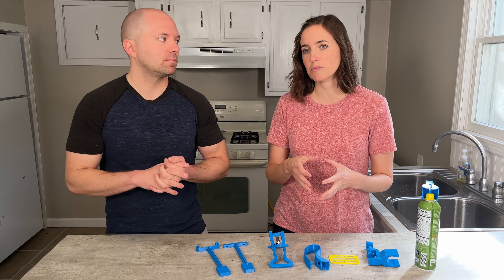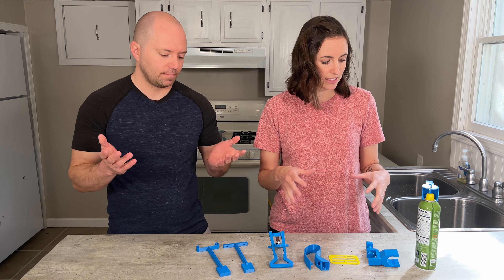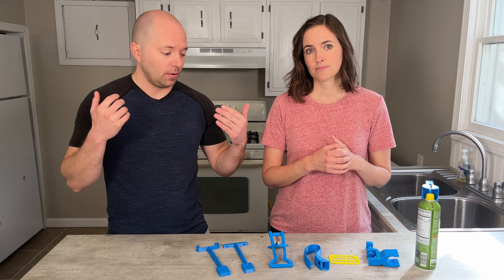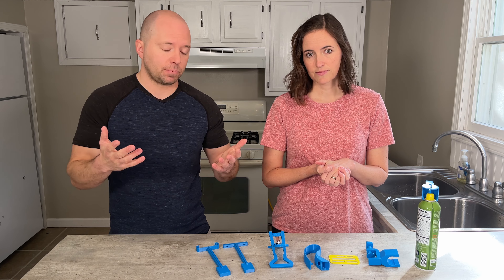We've been 3D printing pretty extensively and we're excited to talk about how to print 3D printable adaptive equipment. It's a great way to bring affordable adaptive equipment to the masses, as well as to trial and work with new adaptive equipment that you're not sure is going to work for your individual. It's just really neat to play with these — and these are a selection of the ones that we've made.